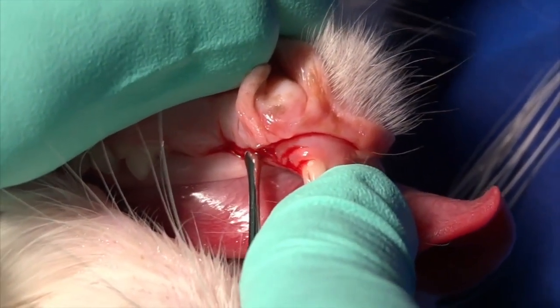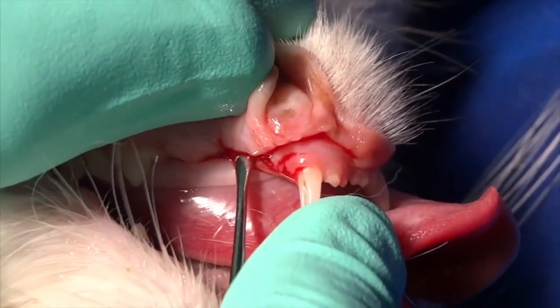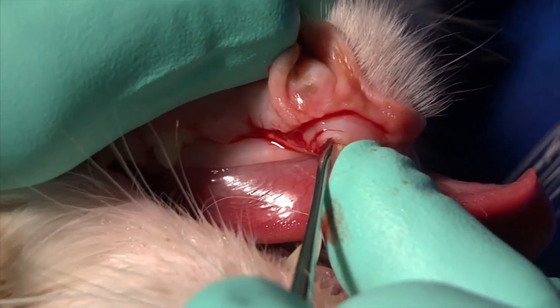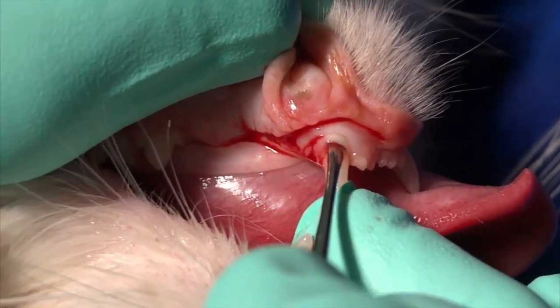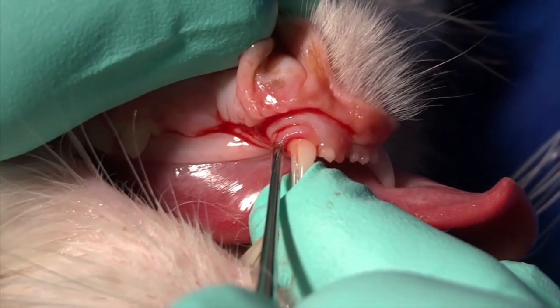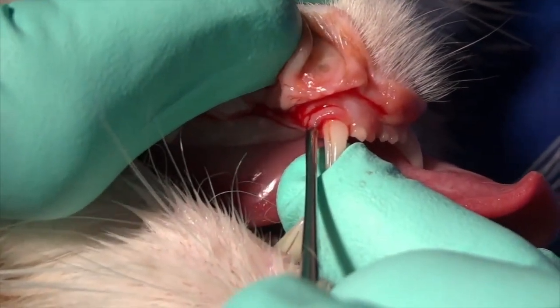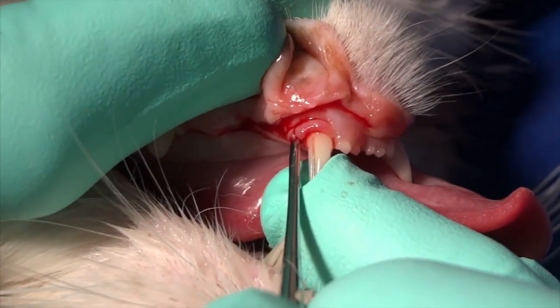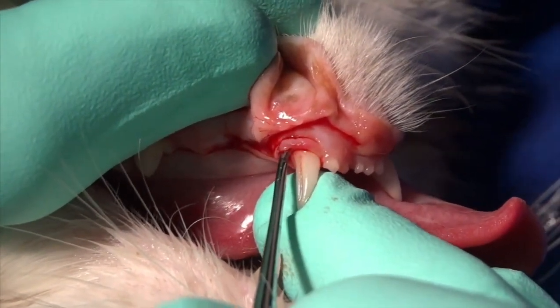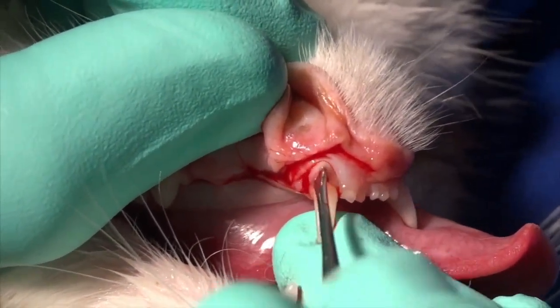Visual observation will give us the determination on how far to go down. We are actually going to be outlining the tooth root as we would normally during extraction, extracting the portion that is still resorbing in the coronal two-thirds of that root. We're using our periosteal elevator to loosen the attached gingiva at the entire margin around the marginal bone.